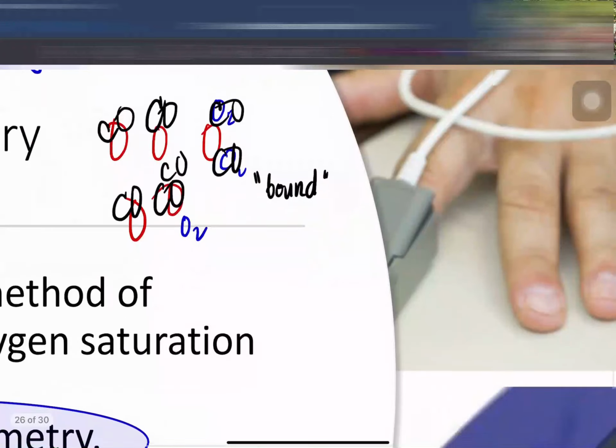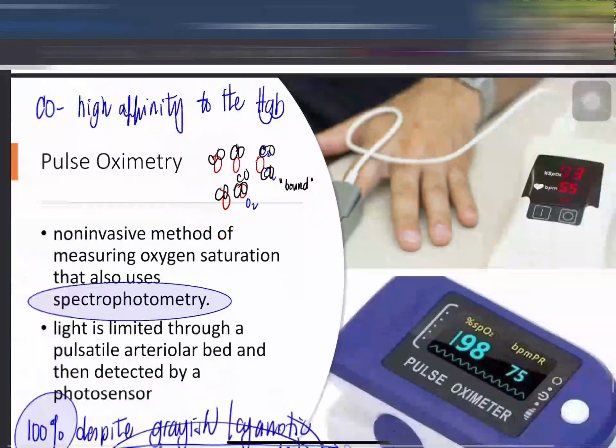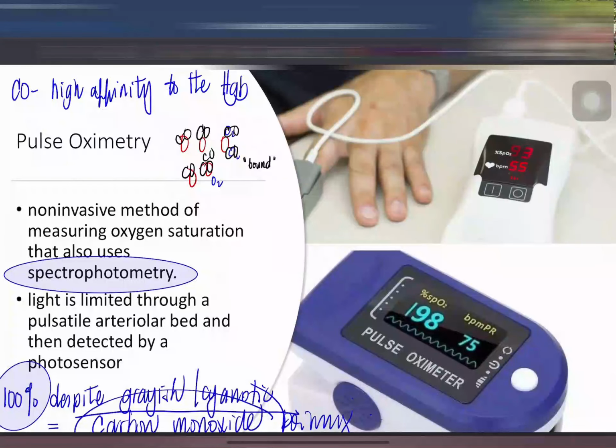Now, what happens here is that the pulse oximeter would read that hemoglobin is occupied. Class, the pulse oximeter would read that hemoglobin is occupied. Hence, it still reads 100% on the pulse oximeter. So why do we have that discussion? To remind you of the point that you treat your patient, not the machine.